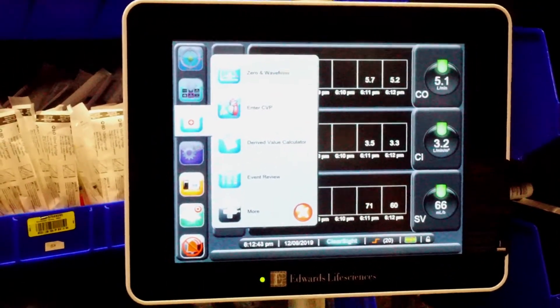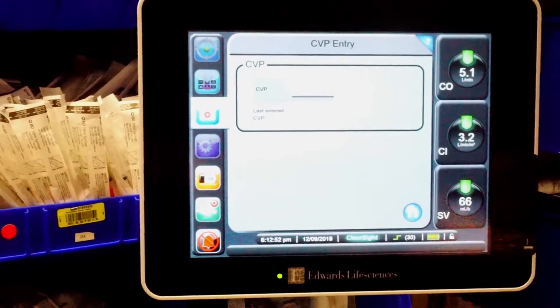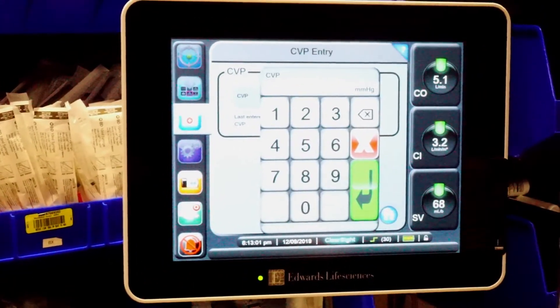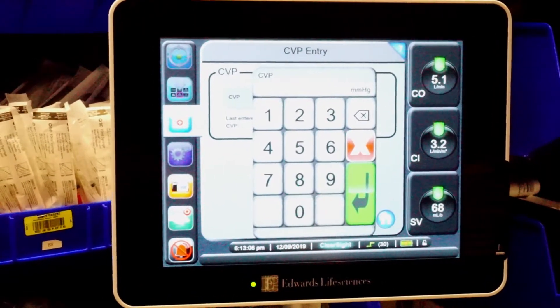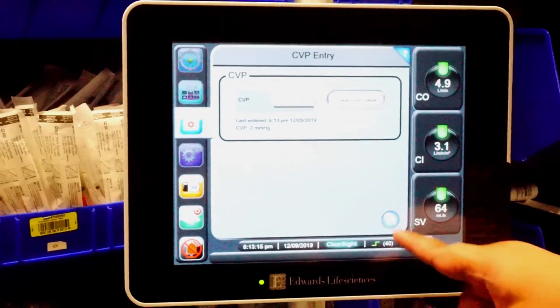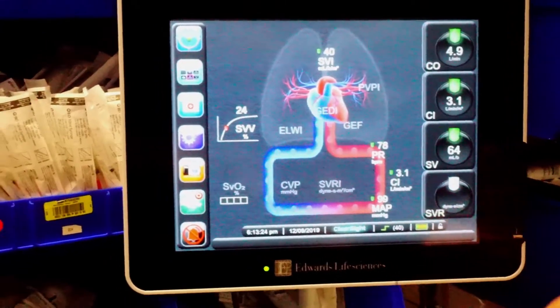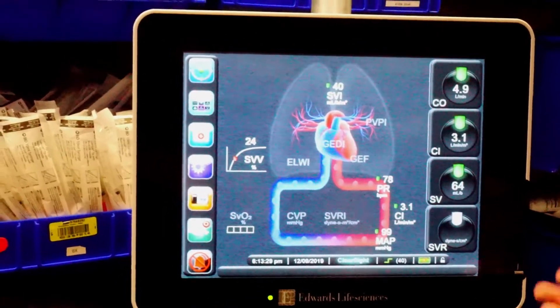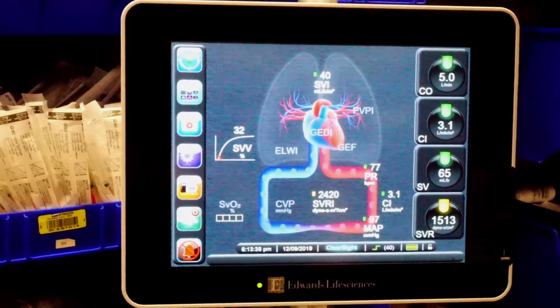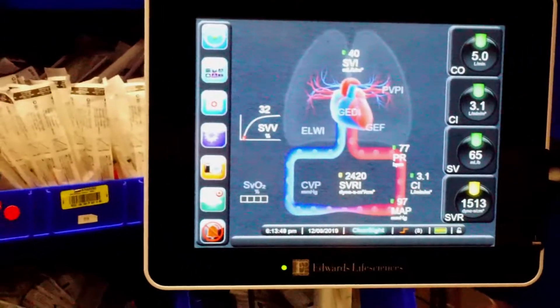Our patient does not have CVP — we cannot measure CVP non-invasively with this machine; we'd need a CVP setup. However, you can enter an estimated CVP value based on your assessment of whether the patient is overloaded or underloaded. For example, with this patient I'd estimate she's dry based on her stroke volume and Frank Starling curve, so I'll enter a value of two. You need CVP to calculate SVR, and once entered, the machine will show the patient's SVR.